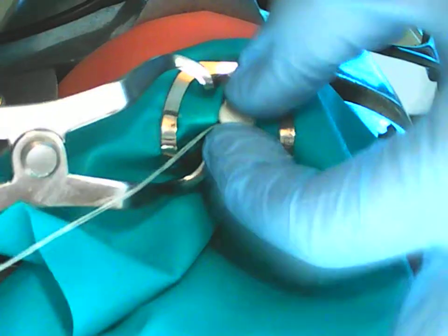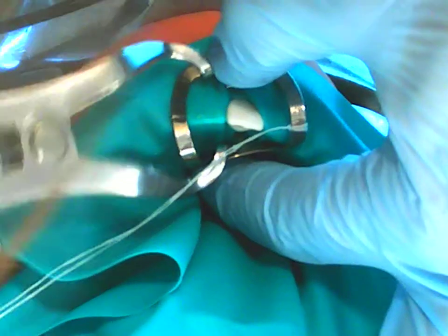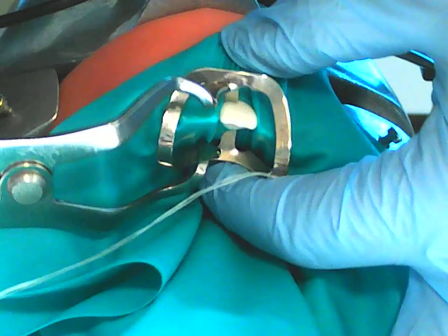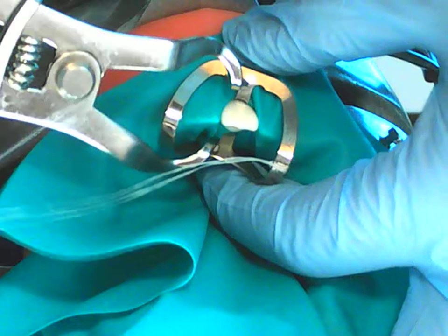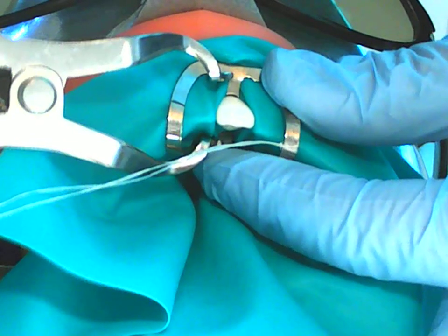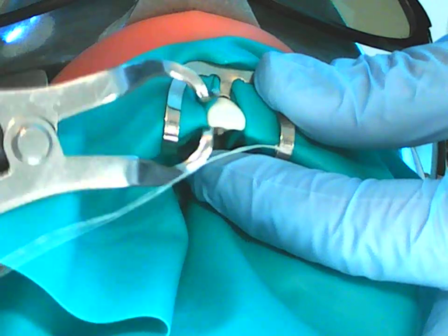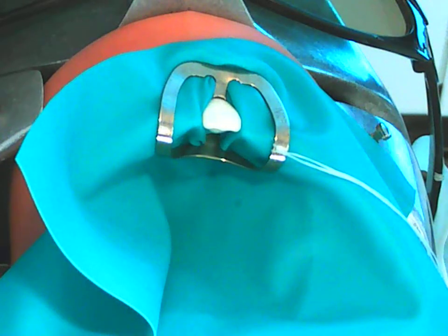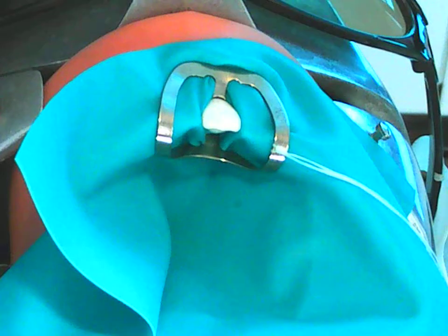Okay, what I checked there is to see if the dental dam is caught under the jaw, and it was, so I'm just replacing it. And I'm releasing it. Okay, going to bring that floss over to the other side. Getting down my forceps, getting my mirror. It looks good.